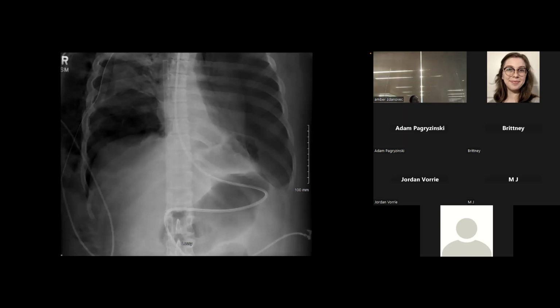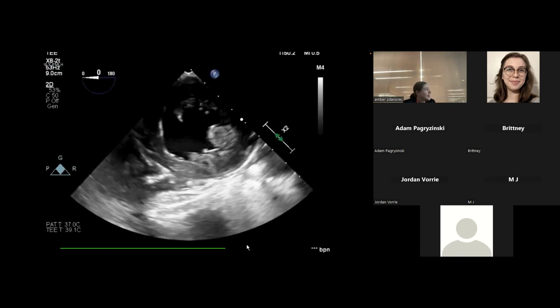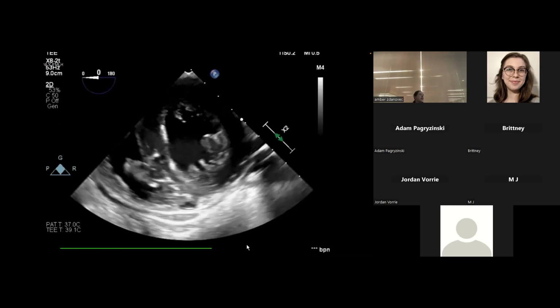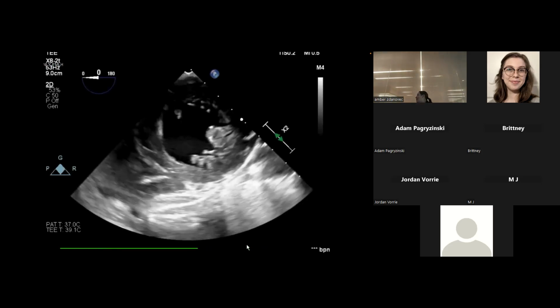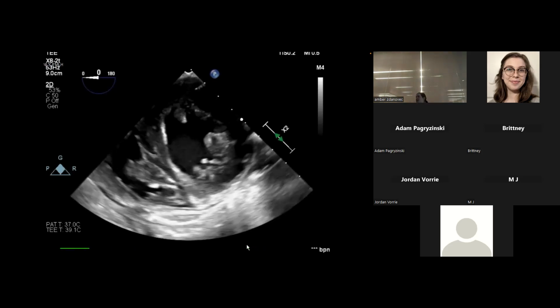But what is missing in like half of his left chest? His lung. What does he have? Is this just tension pneumothorax? He's got a giant pneumo. You can see here's the curvature of his lung. So he's got a pneumo that probably, if he wasn't on ECMO, would leave him dead, or at least crashing, right? So that's when I learned that this is what a giant pneumo looks like on TEE. We just never see it because usually patients aren't stable enough to visualize it.